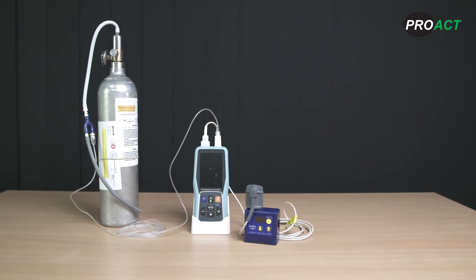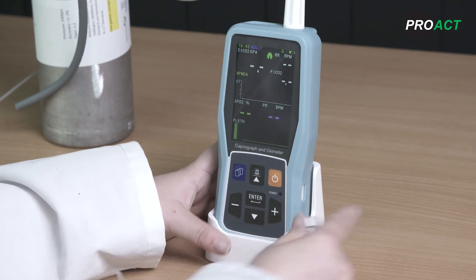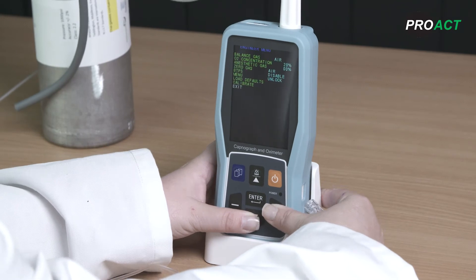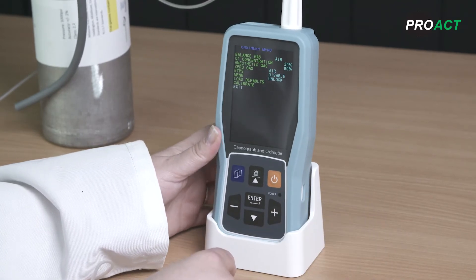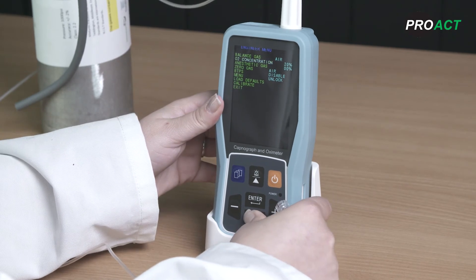CO2 calibration procedure. To enter the calibration menu on the PC-900B, you need to hold down the arrow and plus buttons together until the menu changes. Scroll down to calibration and hold the enter button.